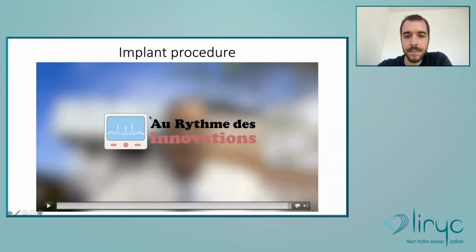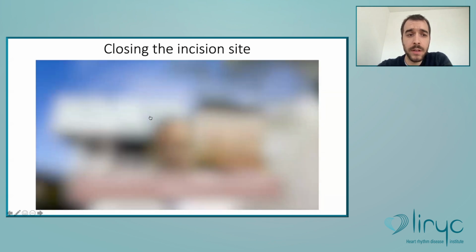All right. So I think I will skip the third video, which is about closing the incision site. You can either close with sutures, surgical glue, or some people even use staples. So any questions on the video?